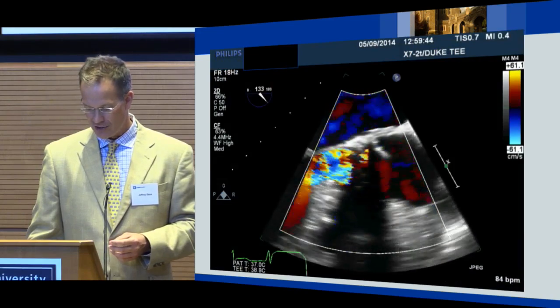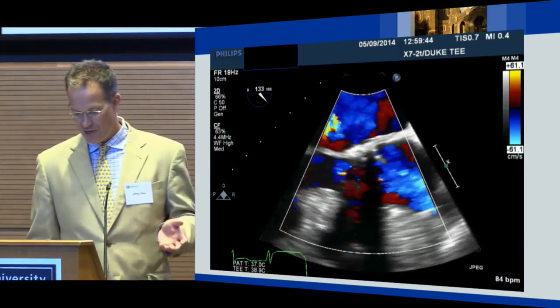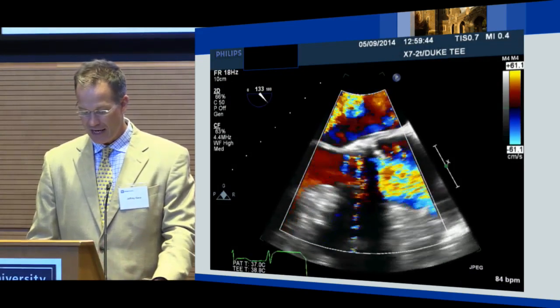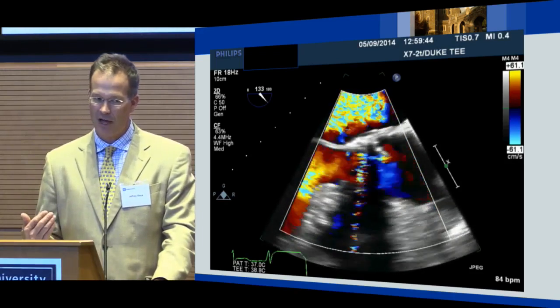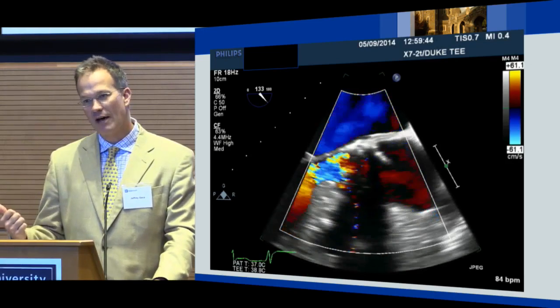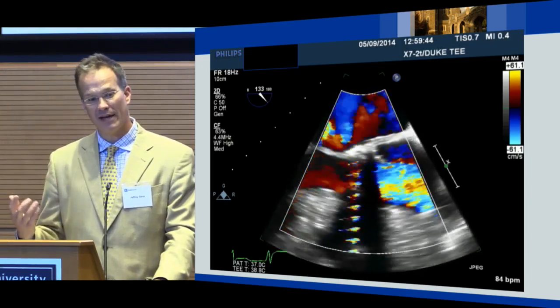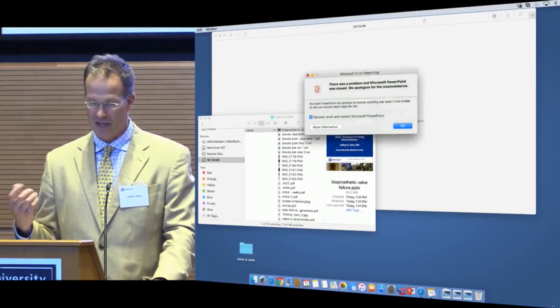And this is her shots from her echo. Is this playing? Oh, good, great. So she has severe AI. She has MR peeking in there too. And I'll talk about this a little bit later, but what's really important in bioprosthetic valve failure, especially insufficiency and regurgitation, is to determine whether it's intravalvar or paravalvar. Because if it's intravalvar, we can help that. But if it's paravalvar, TAVR's not going to do anything for that.